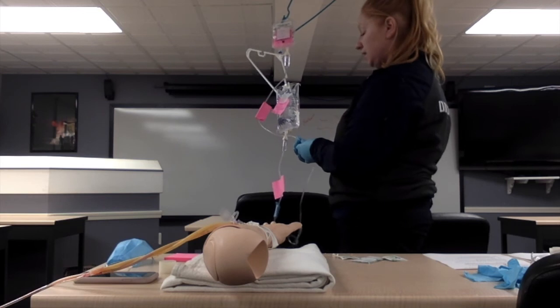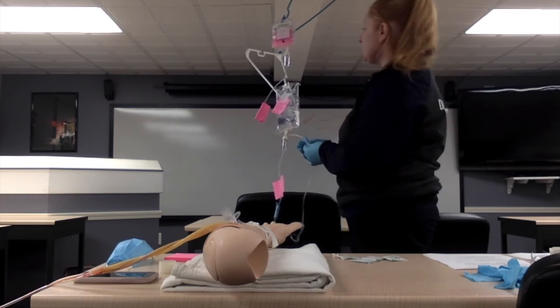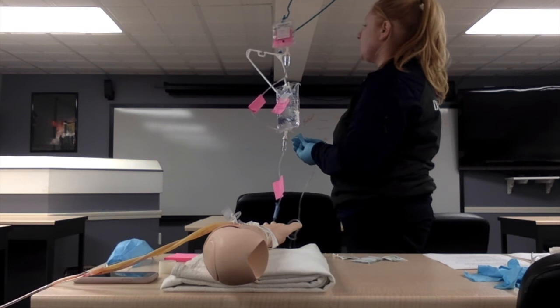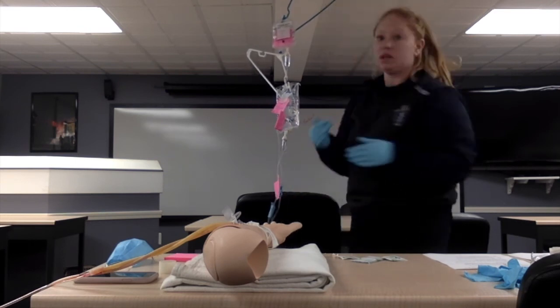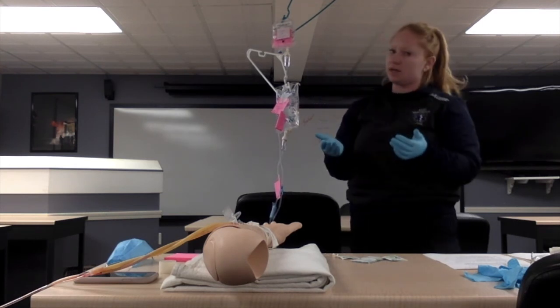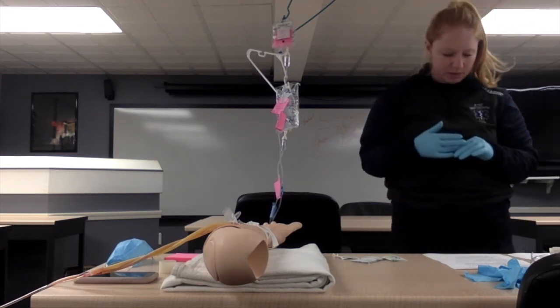Now we have to make sure that it's at the correct drop per minute. So again, it's going to be 1 drop every like 3.5 seconds or so. 1, 2, a little too fast. So a drop, 1, 2, 3, and a half. Obviously you'd use a clock or a watch to get a better count, or a tape that you can use just to make sure that you're getting the proper dose. Again, once you get that infusion, we have that at just about 17 drops per minute.